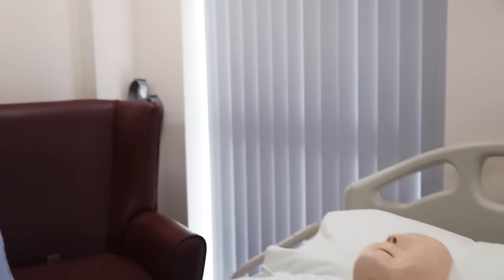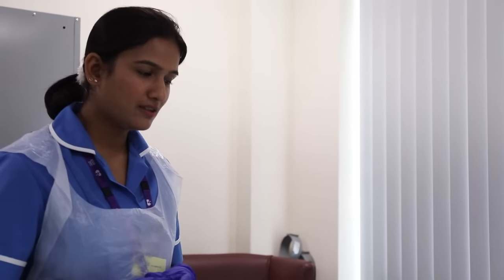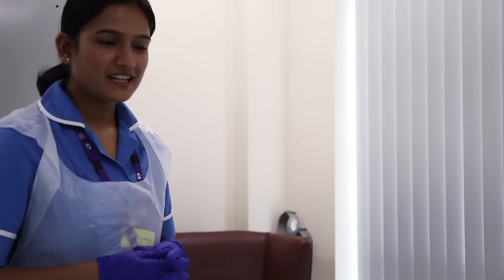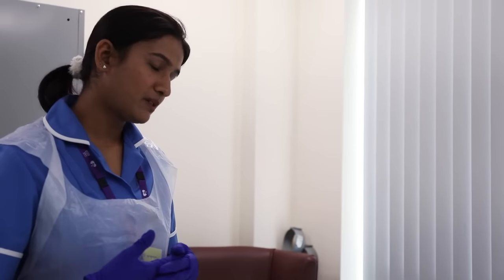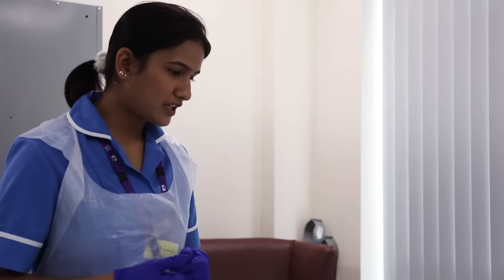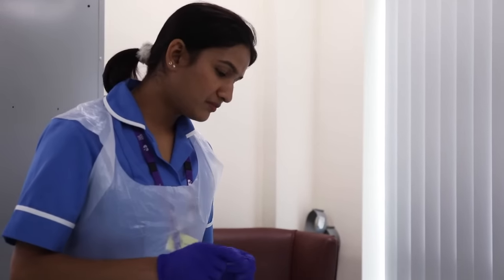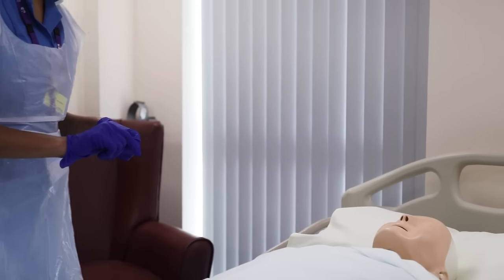Hello. Okay, so you told me why you're getting your zuclopenthixol, but are you aware of any side effects of the medication? No, I've been okay, I've been taking it a while. Okay, yeah. You could get some anxiety or abnormal appetite, but it's very rare that it happens. And even if it happens, we are there to tackle it, okay? Thank you. Are you ready to take the medication right now? Yes, that's fine, thank you. And John, I would be exposing your area. Are you comfortable with that? Yes, that's okay.